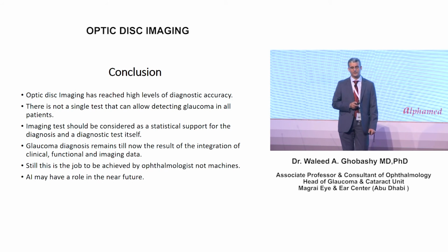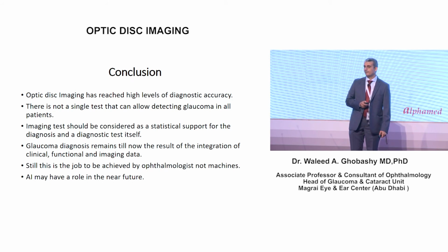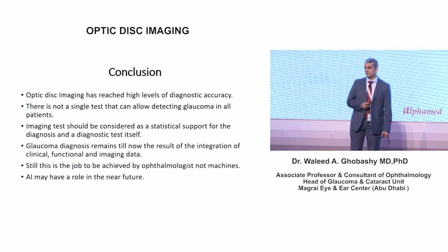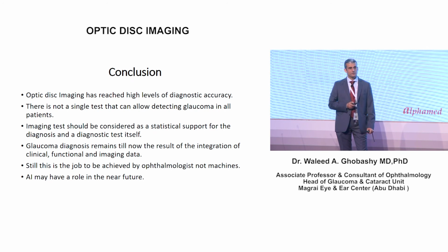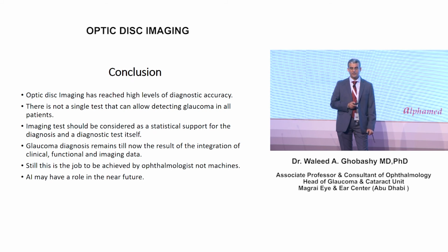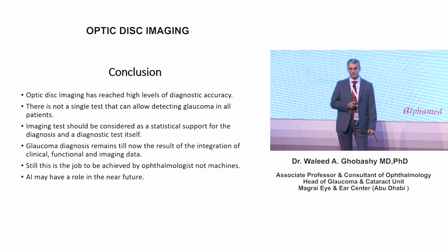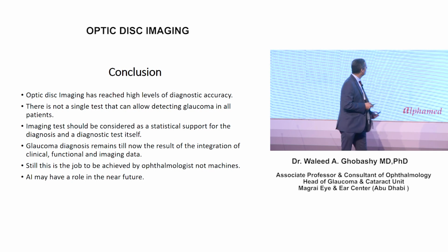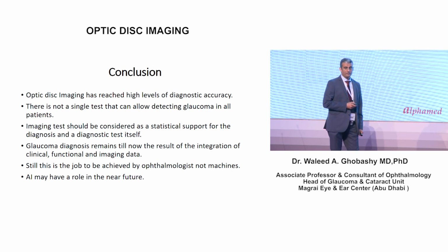So my conclusion is that optic disc imaging is now really advanced. Still, there is no single test available that allows us to detect glaucoma in all patients. In my view, imaging tests should be considered statistical support for diagnosis, and diagnostic tests themselves, but not diagnostic by themselves. The clinical part is very important. Glaucoma diagnosis remains the result of integration of clinical, functional, and imaging data. Still, this is the job of ophthalmologists, not the machines, and I believe artificial intelligence may have a big role in the near future. Thank you.